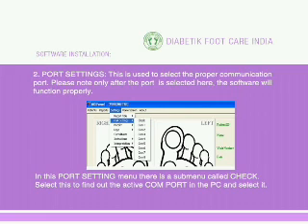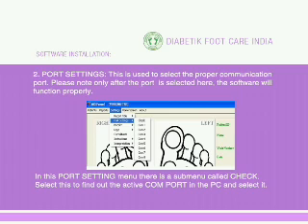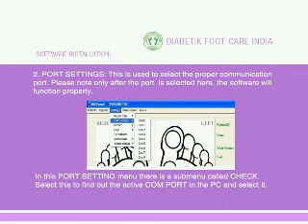Port Settings: This is used to select the proper communication port. Please note, only after the port is selected here will the software function properly. In the Port Settings menu, there is a sub-menu called Check. Select this to find out the active COM port in the PC and select it.